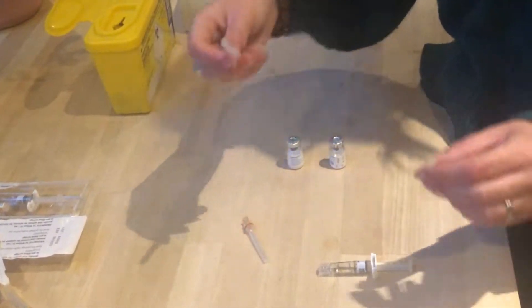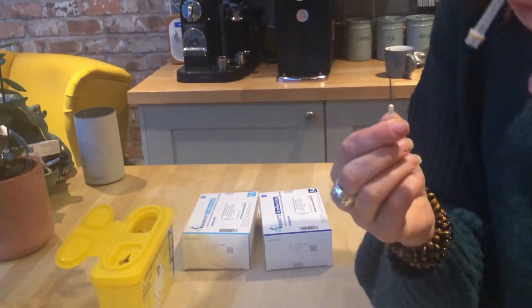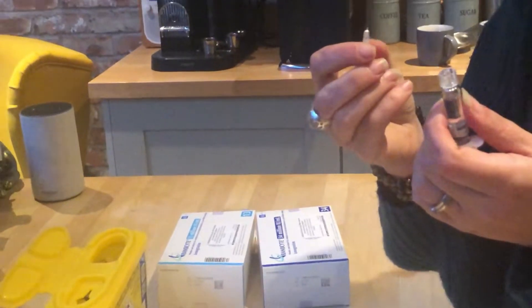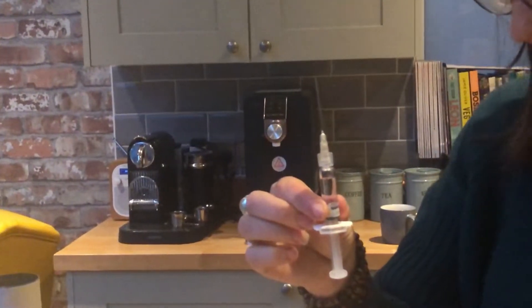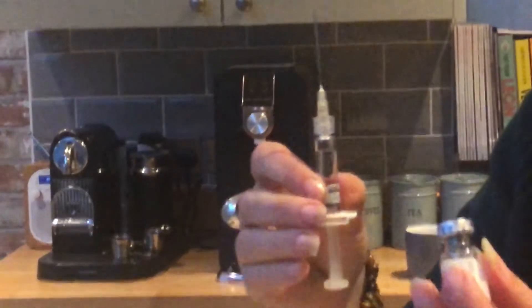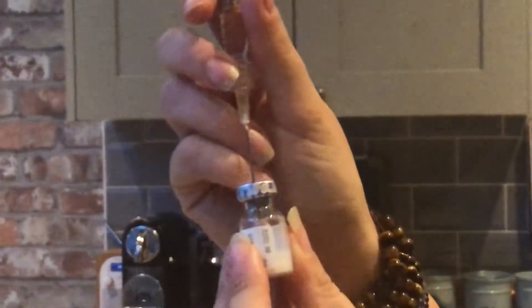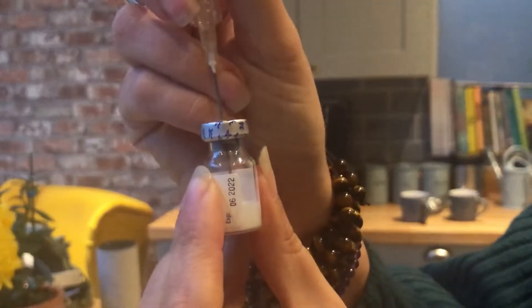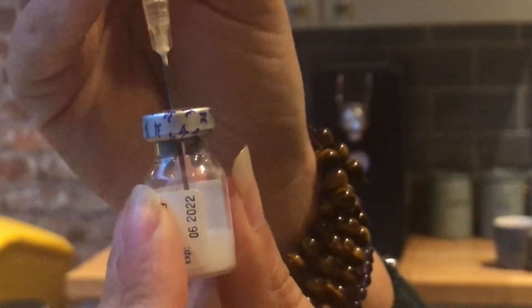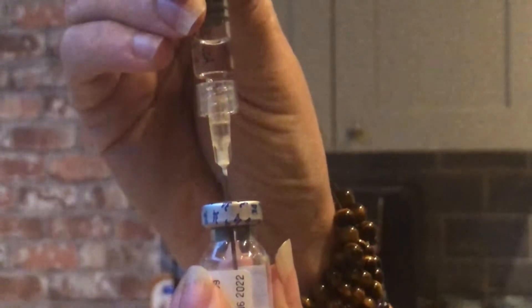First thing you want to do is take the sheath off of the long needle. Put it down because you want to put it away for now. Get your syringe solution and just twist that onto the top. Get one of your bottles of powder and you want to pierce the top with the needle — push down strong. What you want to do is push about half of the solution into the bottle. About half, doesn't have to be exact.